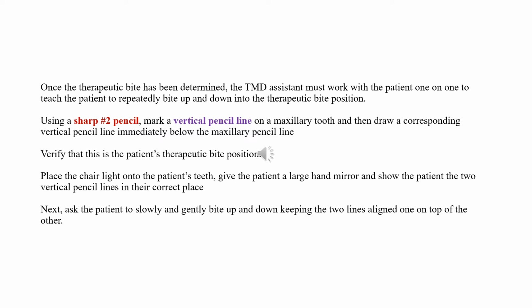So in other words, the patient taps first, just taps, and then the opening gets bigger, and then taps again, and the opening gets bigger until you can put a wax wafer through there, and they'll still bite in the right bite. Got it? And this is the starting point. This is what you're coaching. You're teaching them to do alligator bite, rotation, open, close on this therapeutic bite position.